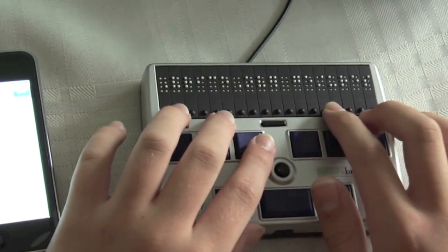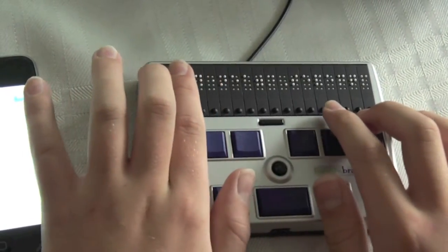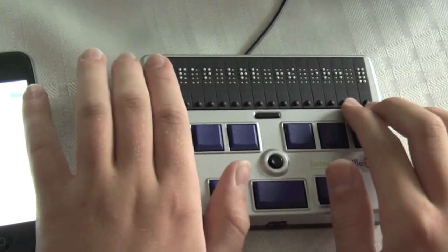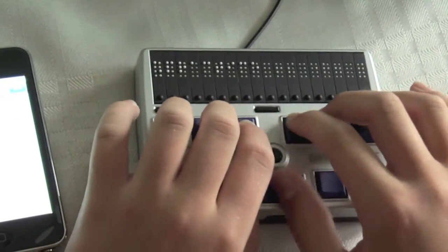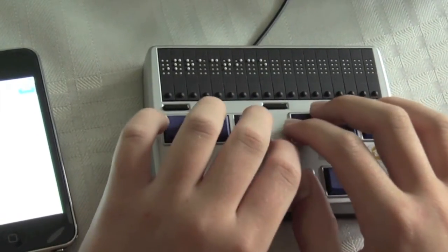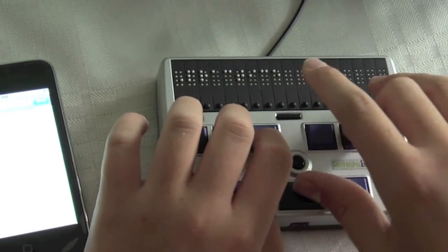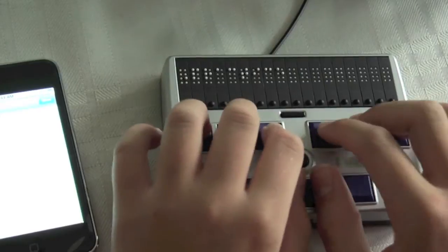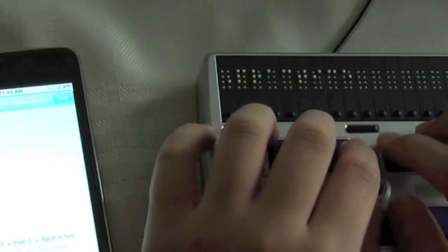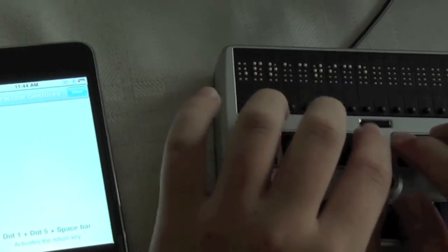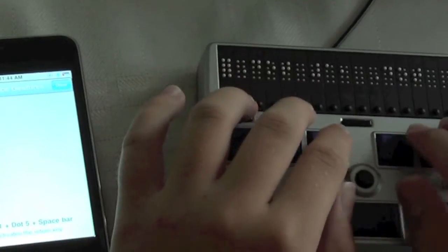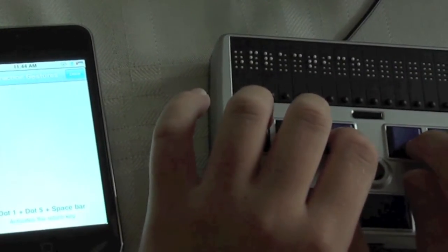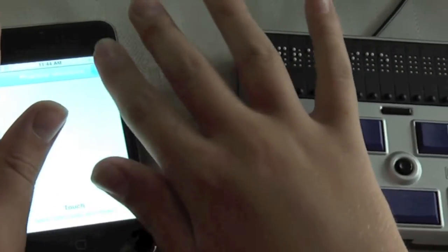I'm panning to the right and it's showing what it just said. But if I get to the end it will tell you that that's the pan rail to the right. We can also use corded commands. That is letters and symbols with the space bar, and it will tell us what they do. So H chord for example activates the home button or activates the return key.